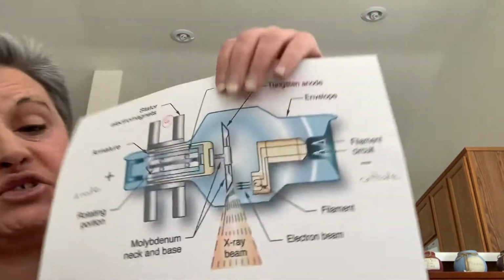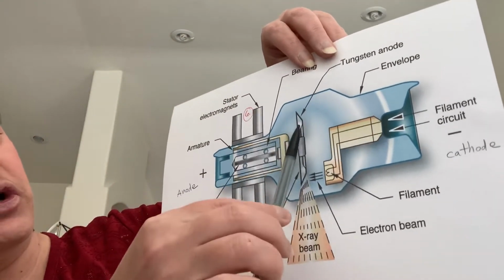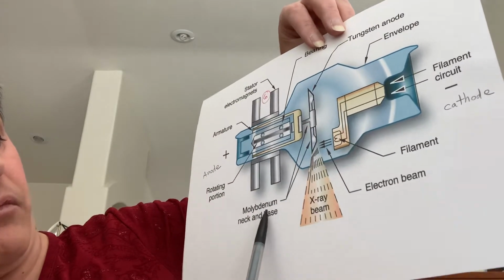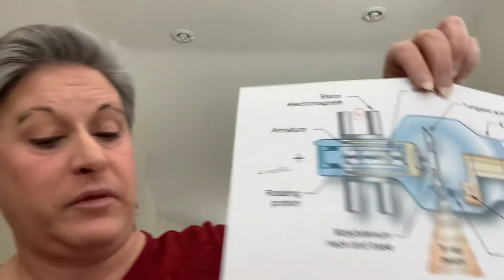The filament is made of tungsten because of its high melting point, and it's difficult to vaporize. Rhenium and molybdenum are also used because of the same properties. So tungsten is going to be used here, and also molybdenum and rhenium.